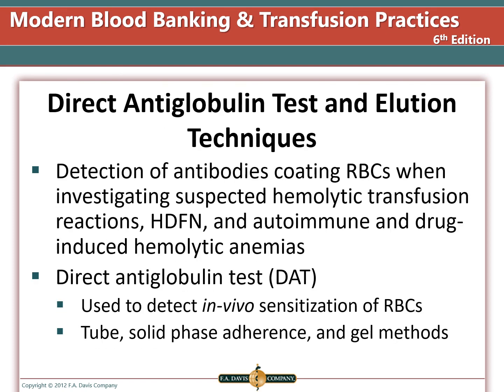The direct antiglobulin test, or DAT, is used to investigate hemolytic transfusion reactions, hemolytic disease of the fetus and newborn, and autoimmune and drug-induced hemolytic anemias. The test detects in vivo sensitization of red blood cells. The process can be accomplished via tube method, solid phase, or gel technique.